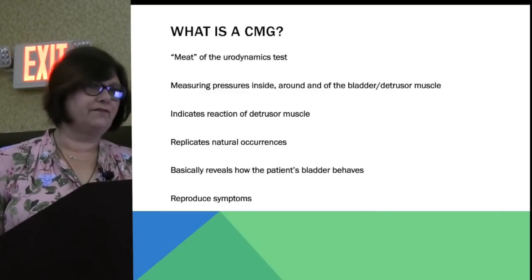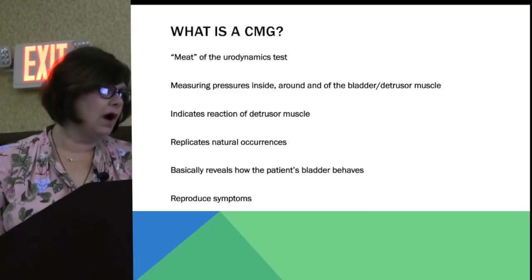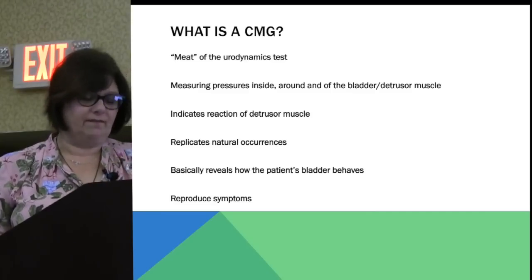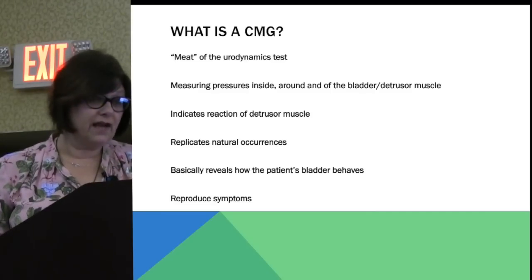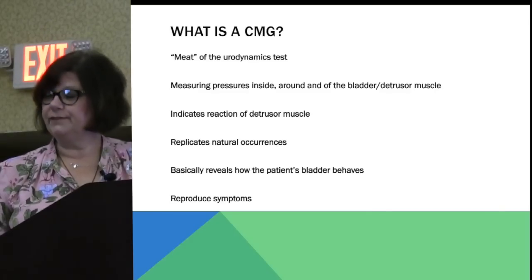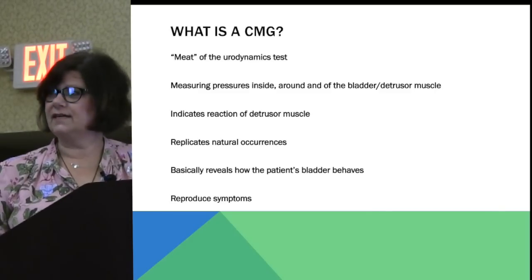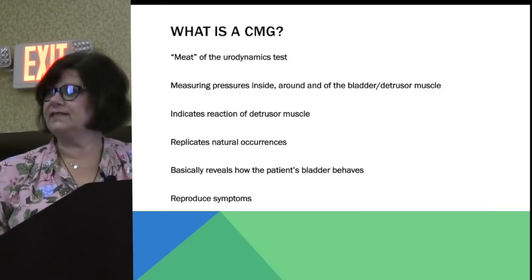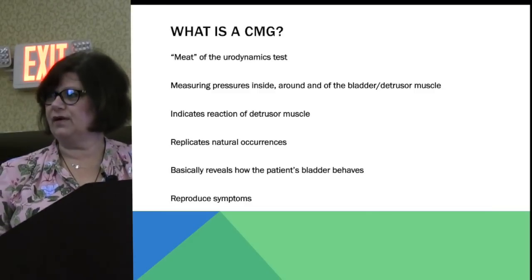Why are they in here? We're trying to figure out their complaints. So when we do the urodynamics, we are trying to replicate that complaint. We're filling the bladder with water, just as the body would fill the bladder with urine. We're repeating that process and getting a tracing on it, and we're able to read that tracing and figure out exactly what their issue is.